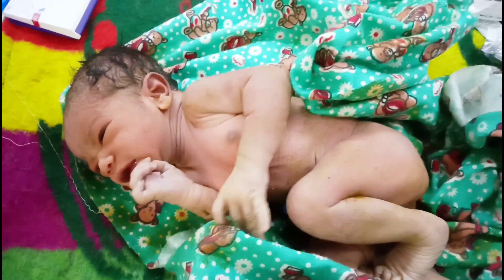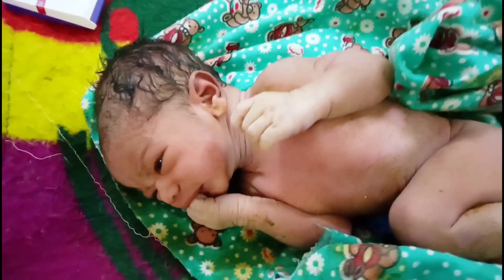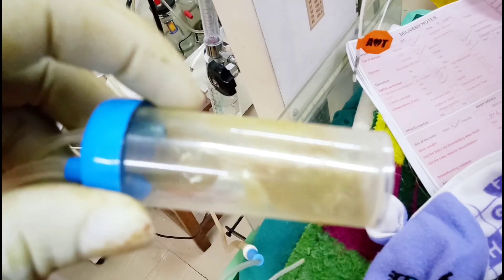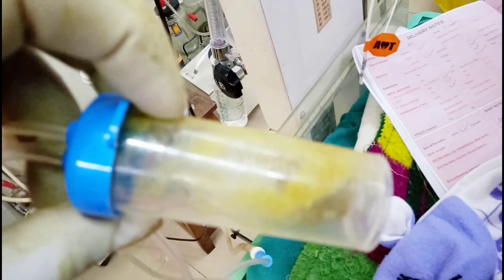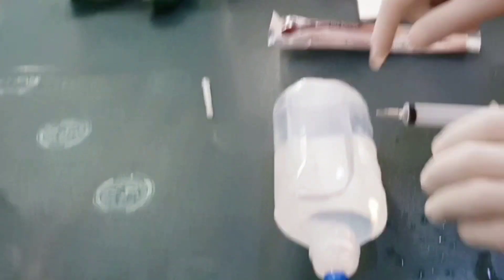This is a newborn baby who was deeply meconium stained. He drank dirty meconium during his intrauterine period, so I have to aspirate the meconium and lavage.